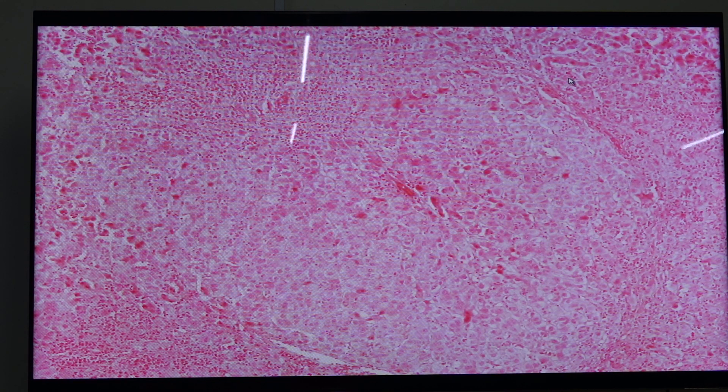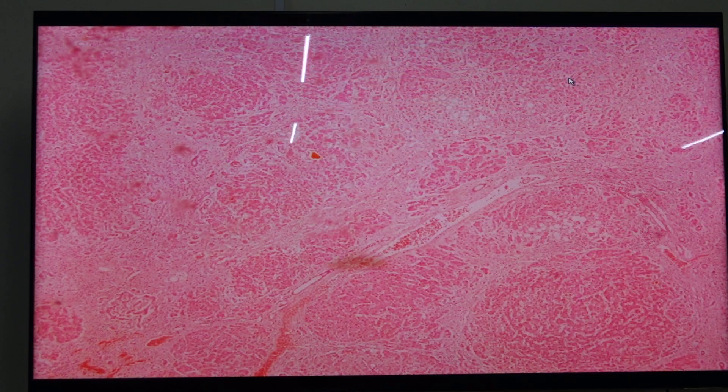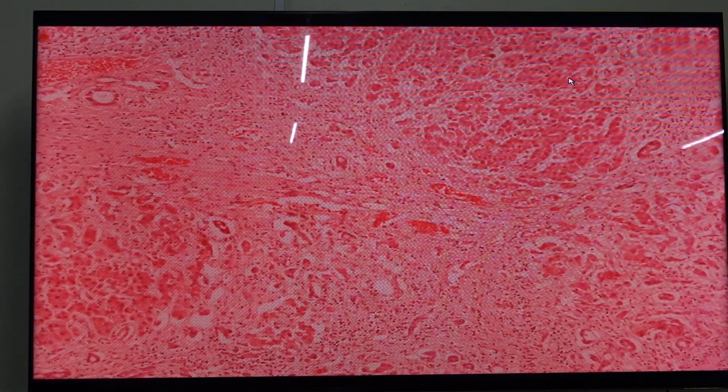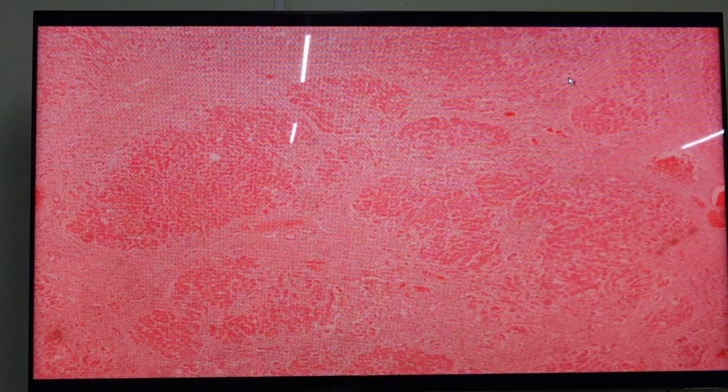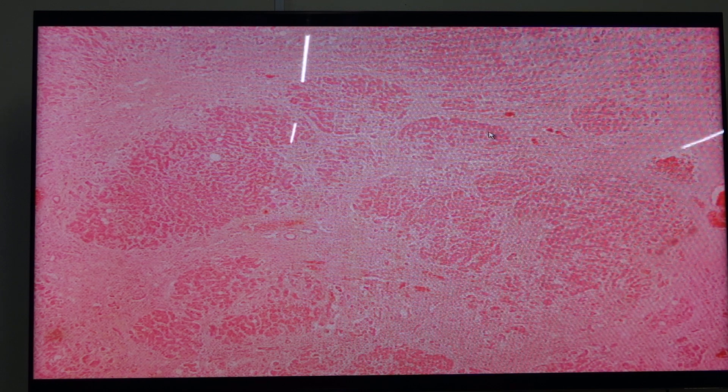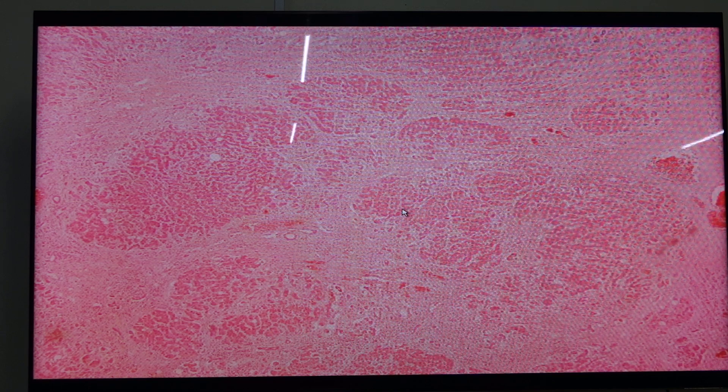Next we have slide 34 — alcoholic liver disease. The ethanol is the culprit here, and this is a late stage of the disease because you can see the presence of nodular formations of hepatocytes, which means it is cirrhosis.